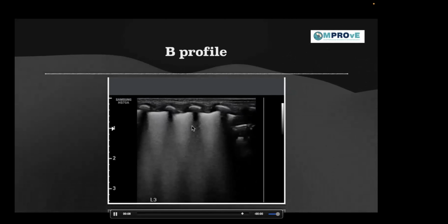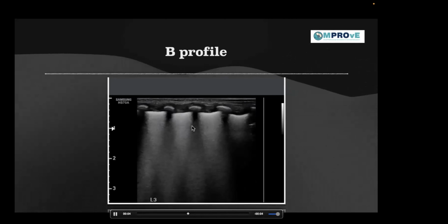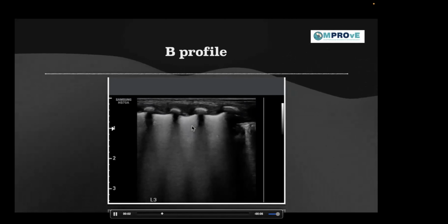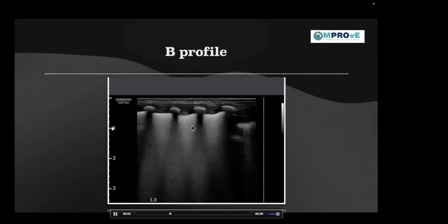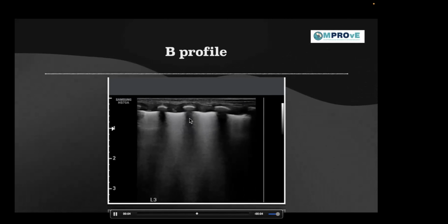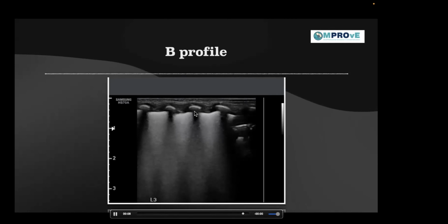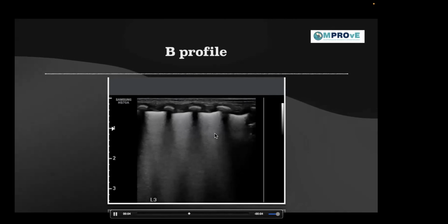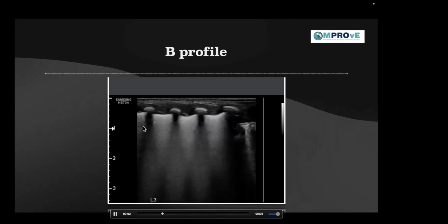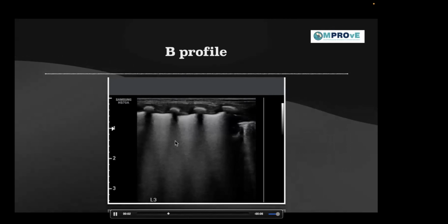It's vibrating all throughout, and because ultrasound machines don't have a brain to think, it generates an image throughout, and you lose out on your acoustic shadowing. So the more the severity of the RDS or the pathology, you will see completely white out. You will see in some of the pictures that it is completely white out.